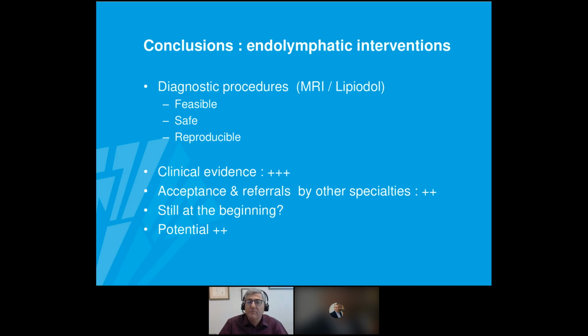Thank you, Geert. Another question: do you puncture the peripheral or central portal vein for protein-losing enteropathy? Well, you have to occlude the lymphatic communication between the liver and the duodenum.